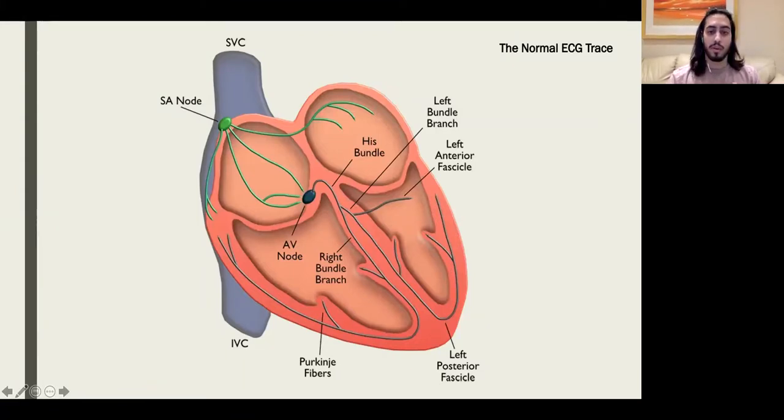So what we'll start off with, we're going to decide to put a couple of electrodes on. And for the sake of this, just trust me, we're going to go with lead 2, okay? And it will all make sense later on in the talk. But we've decided to put a negative electrode up here and a positive electrode down here, okay? When, like I said, you have a negative electrode and a positive electrode, you form something called an axis. So lead 2's axis is going in this direction, okay? From negative to positive, okay? That is the axis of lead 2.